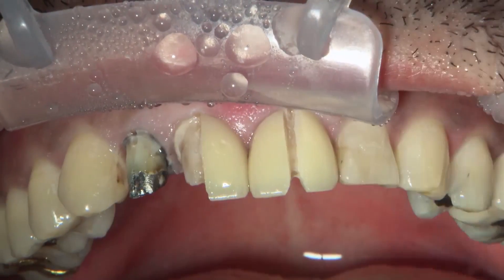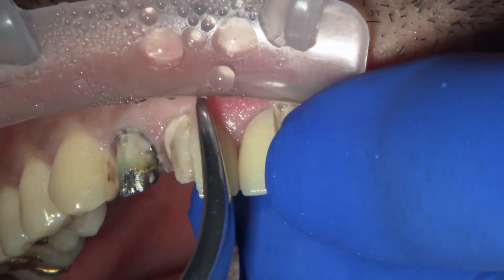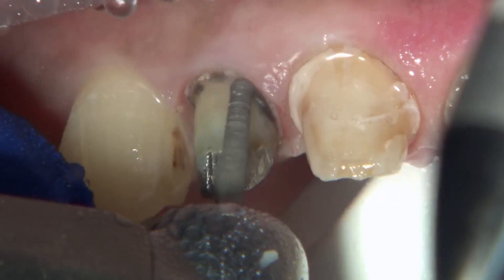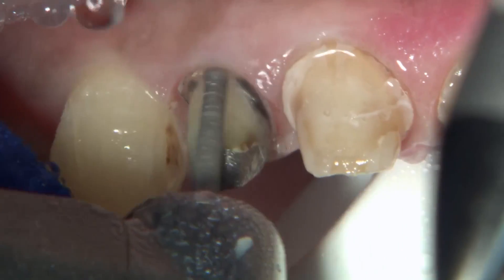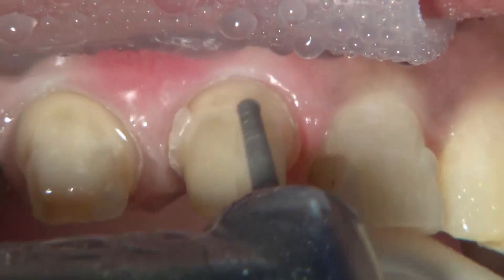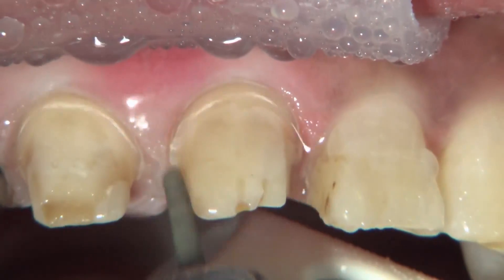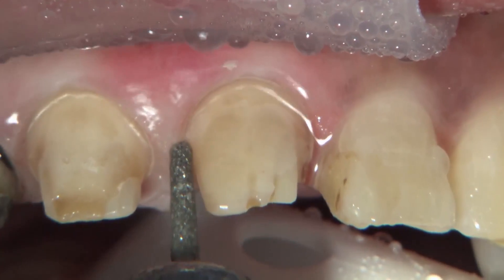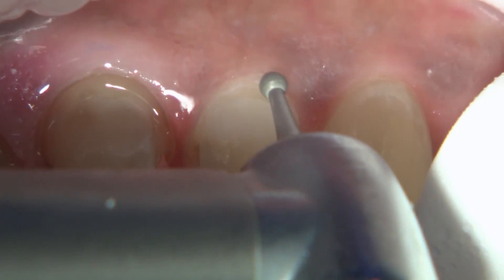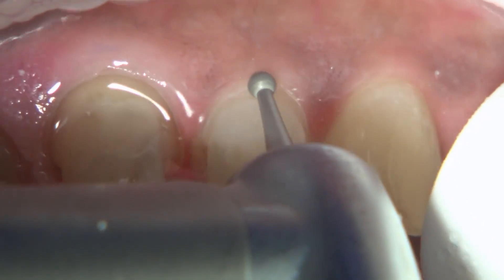Dr. Mirsan, after getting the patient numb, went ahead and removed the old crowns. Now she's prepping the margins and making sure that any recurrent decay is cleaned up from around the margins of these teeth. You want to make sure that you clean everything up after removal of the old crowns, and certainly there was some leakage around these where they had to be removed.